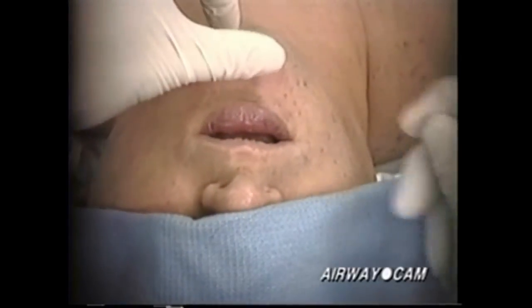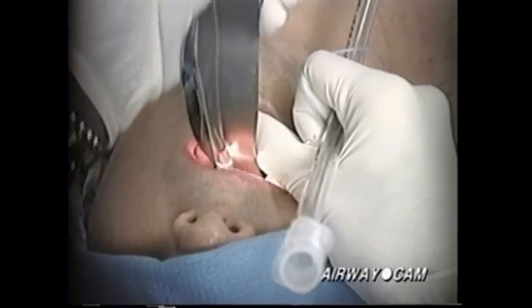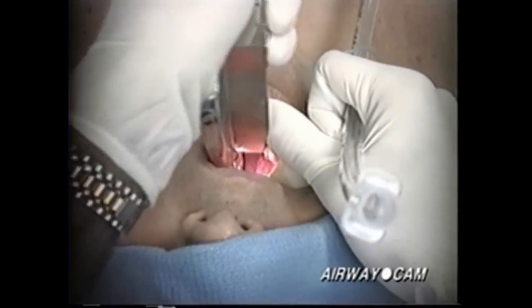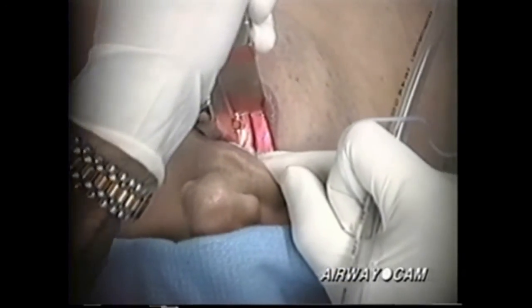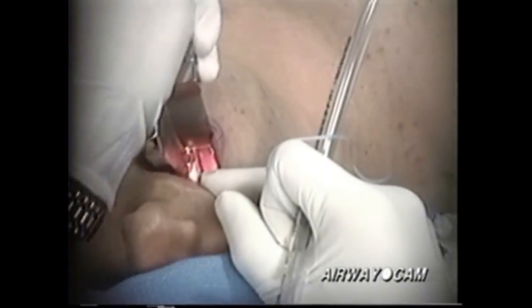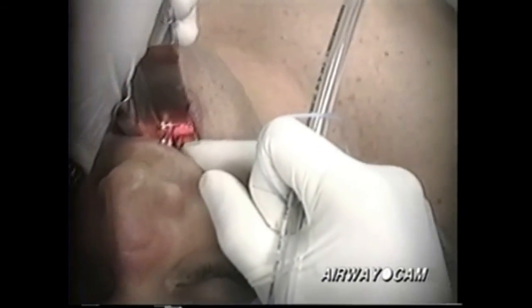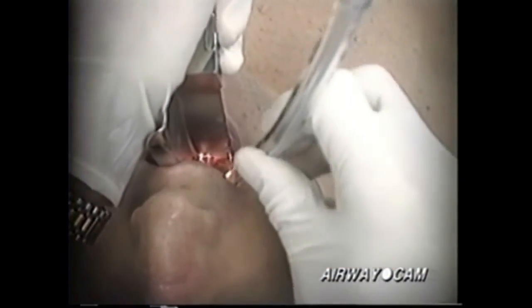The next intubation is with a Macintosh No. 4 blade on a young man. Following a scissor technique opening of the mouth, the posterior pharynx is visualized, and the blade further advanced until the tip of the blade fits into the vallecula. The edge of the epiglottis and the posterior cartilages become visible. While maintaining a view of the target, the tube is passed down the right side of the mouth.